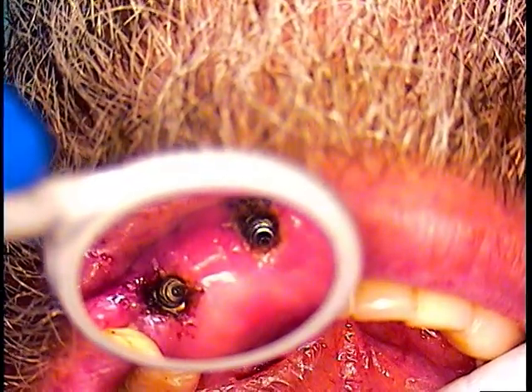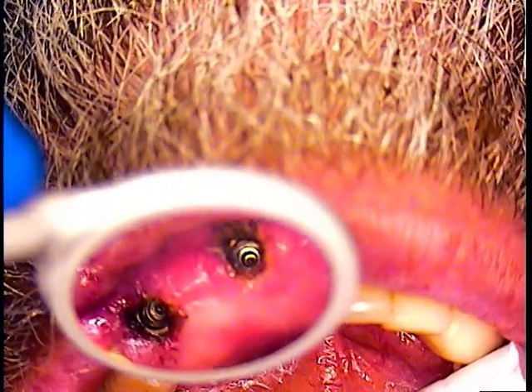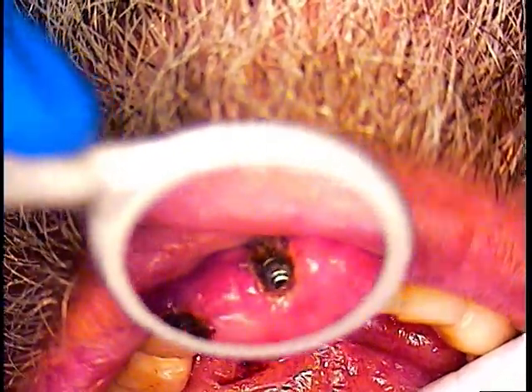That's where we're at. So next step is to put the healing abutments. I'm going to pre-clean these out right now, and then we'll try in the healing abutments. Again, Dr. Gerry Cuomo.